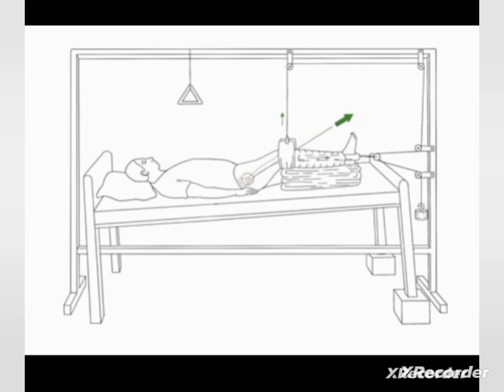The knee joint is bent and the client can move about with relative ease.